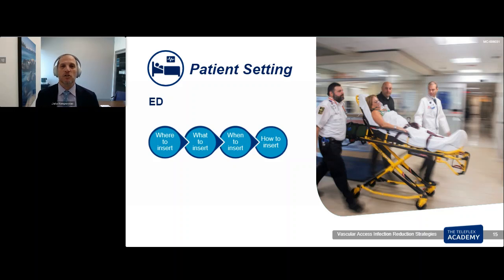So if that's the position you find yourself in, where you cannot appropriately perform a central line insertion following appropriate sterile technique with full barriers, following all of the central line insertion checklists, then don't put in the central line. Place an IO. You can resuscitate through it. It's extremely quick and extremely effective. And only when you can follow the proper technique should you place the central line.